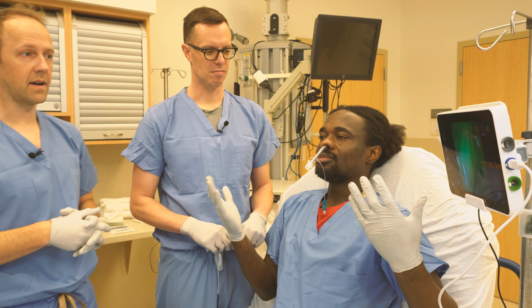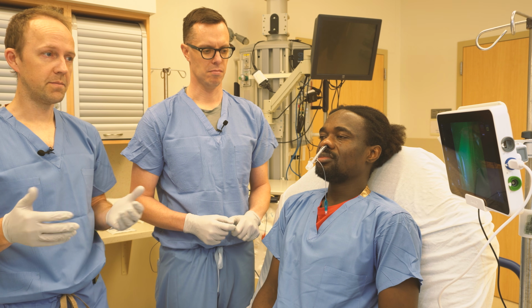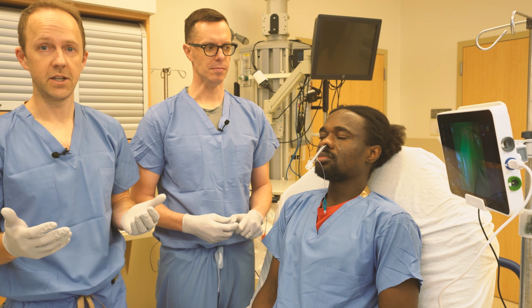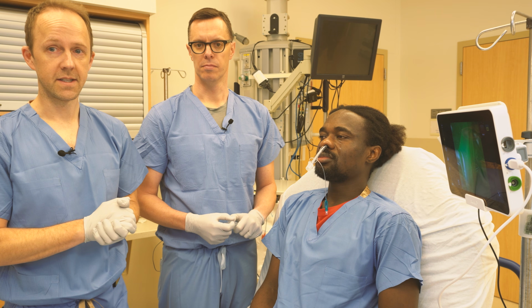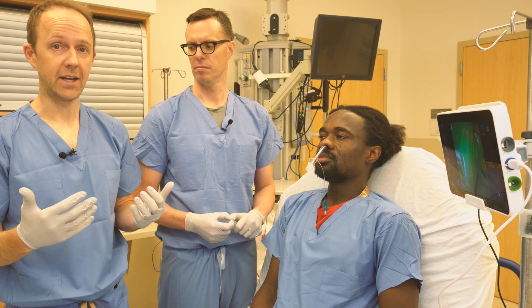At this point, oftentimes it helps to now give some sedation so that they're very comfortable. But if you've coached them through it really well and given really good topical anesthesia, they might not need aggressive sedation at this point. It really depends on the clinical scenario for you. But this is a good way to intubate your patient while keeping them completely awake without any sedation at all.